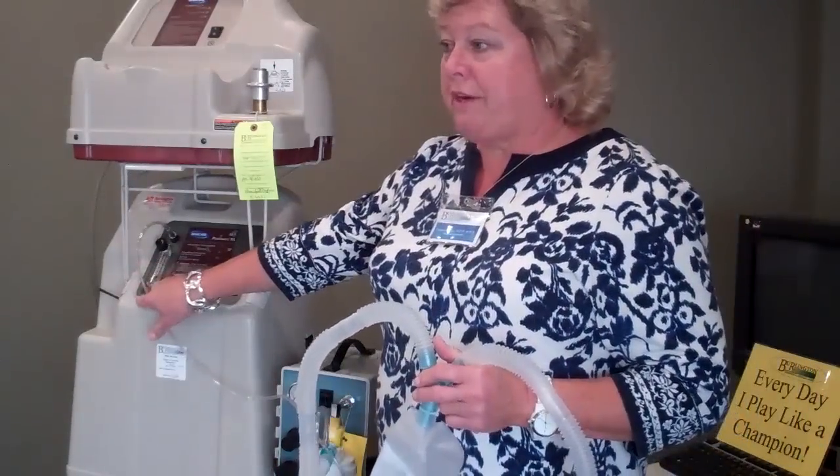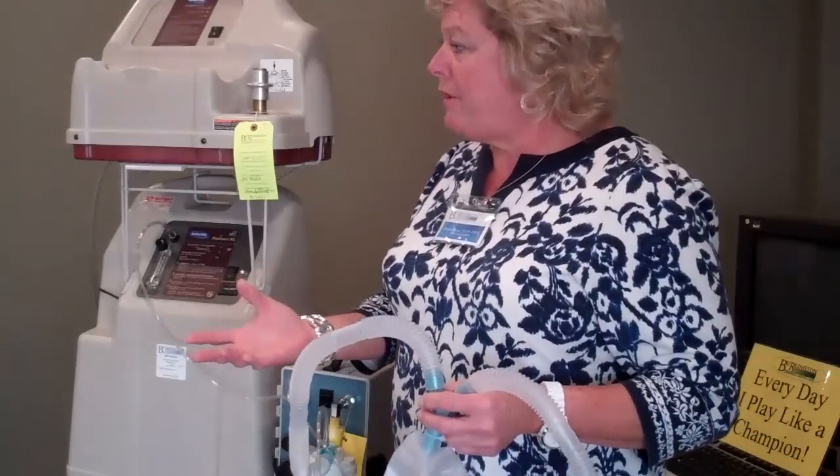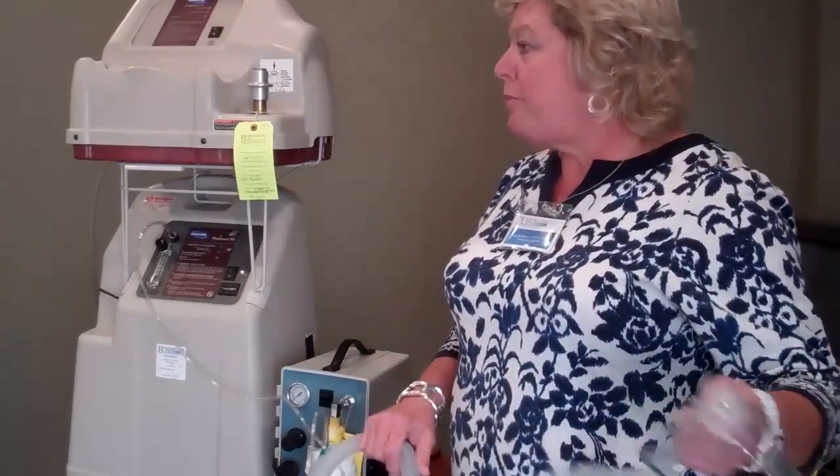These bottles are not humidifiers like you'd put on a concentrator. They're nebulizer jars, just like you use to produce a nebulizer with a handheld neb. You're going to get a mist when you put it out.